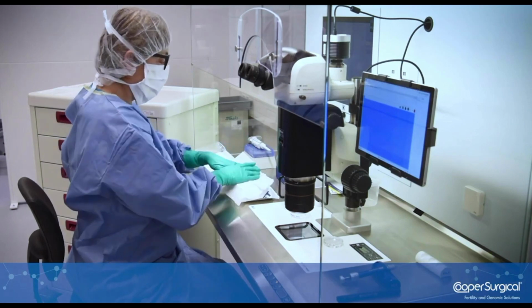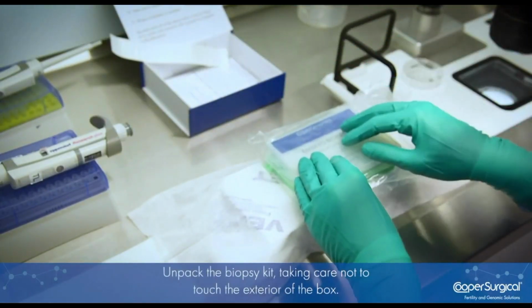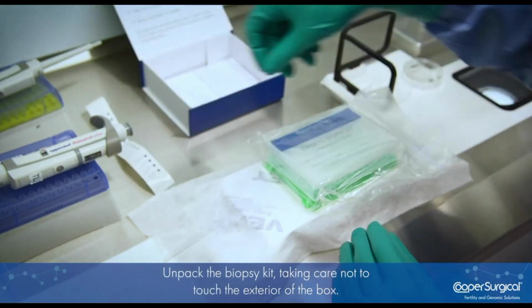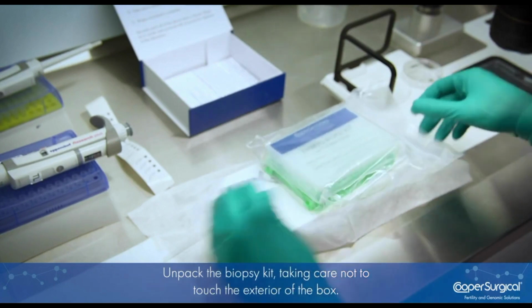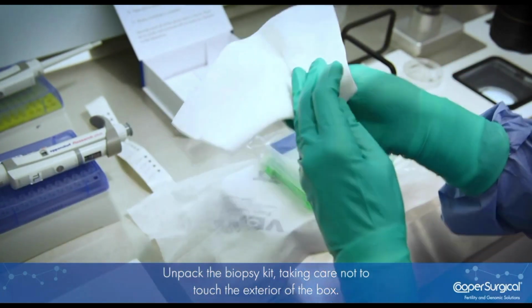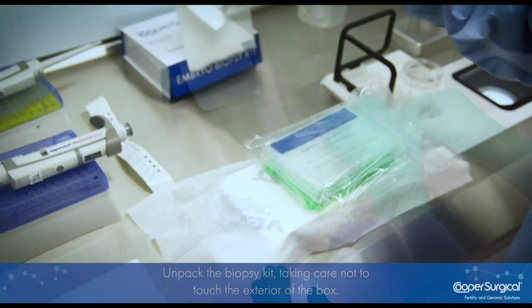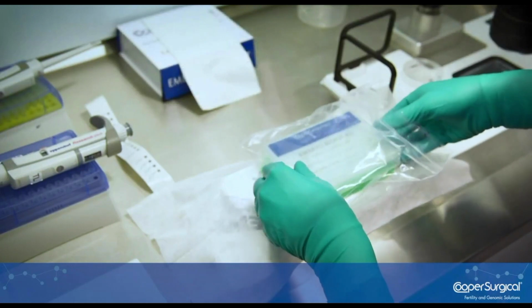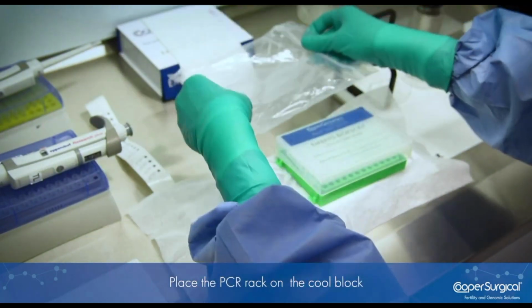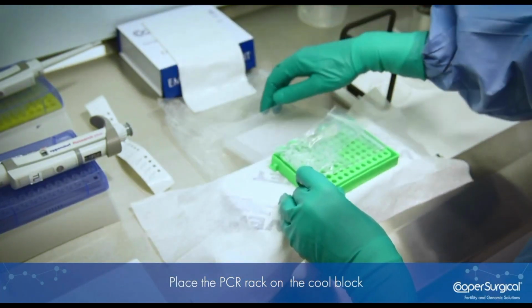Here we are putting a sterile cloth over the cool block. We are taking the sample rack box from the embryo biopsy kit. All this is DNA RNA free, so we can touch that with our sterile gloves. Now, this way, I pushed away the box. The outside of the box, of course, is not clean, so I use a sterile cloth to move it. Here we take out the sample rack box, put a plastic bag behind it, and we will open it.